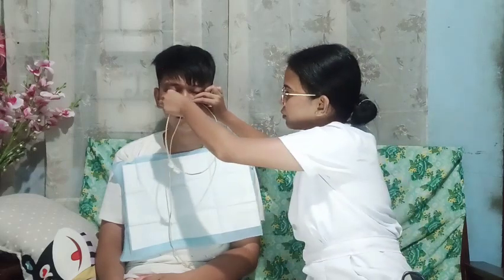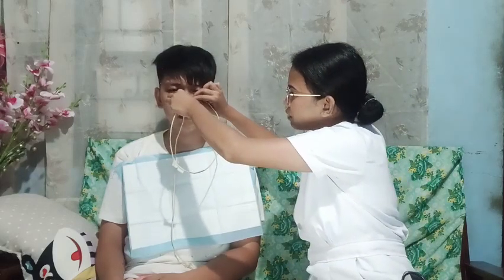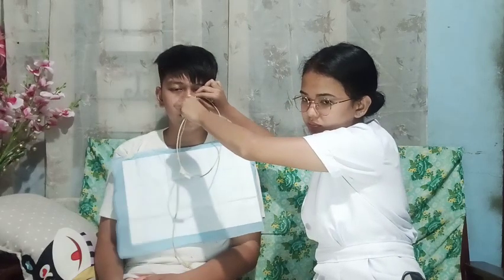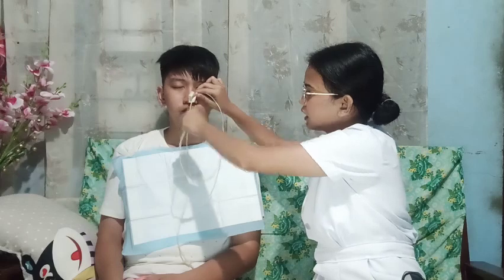Then after that, ask the client to take a deep breath, and then hold the breath if they can, or exhale slowly. Okay, sir, when I remove your NGT tube, just breathe deeply. Breathe deeply. Okay.